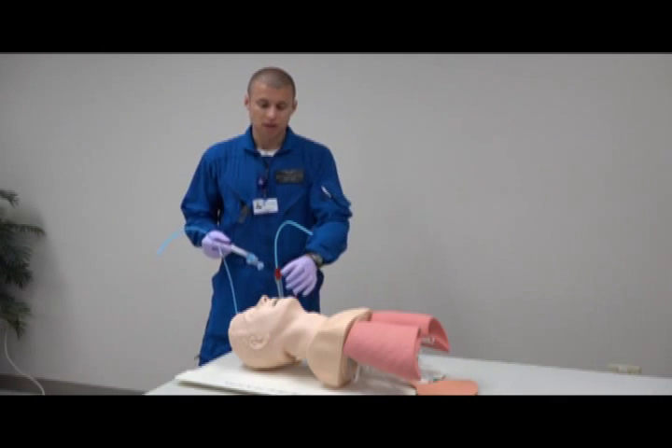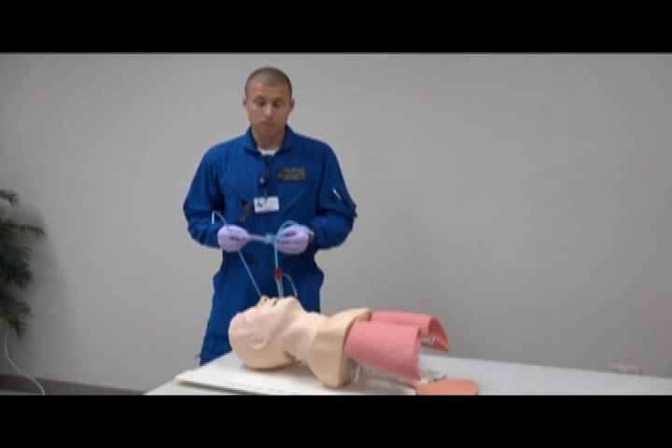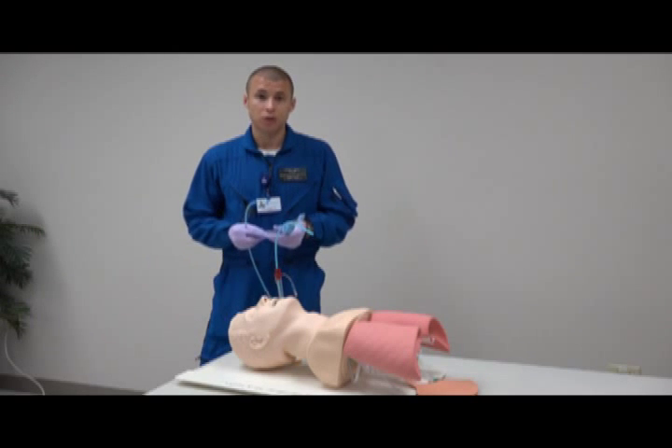You're not getting good lung compliance, you're not hearing good lung sounds even after multiple adjustments with the King, so you feel like the patient's airway needs to be secured via endotracheal tube.